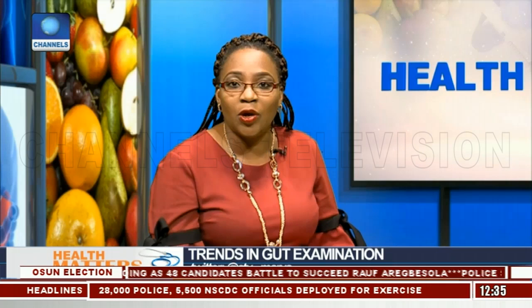In the procedure known as gastrointestinal endoscopy or GI endoscopy, a doctor is able to see the inside lining of your digestive tract. The GI endoscopy procedure may be performed in either an outpatient or inpatient setting. Through the endoscope, a doctor can evaluate several problems in the gut.